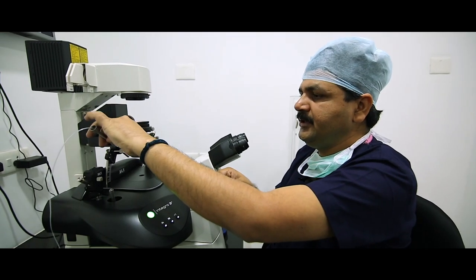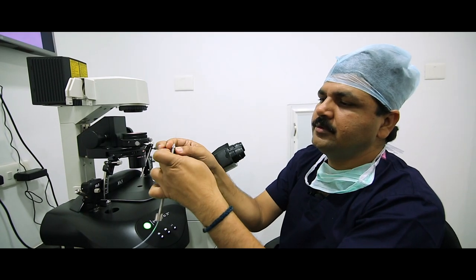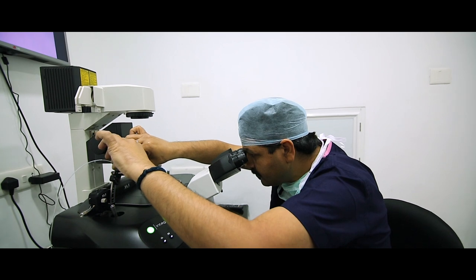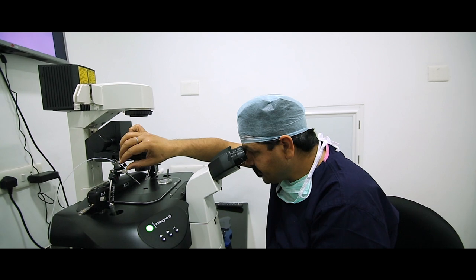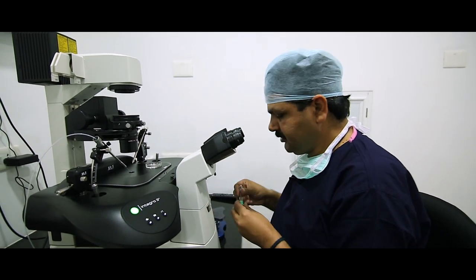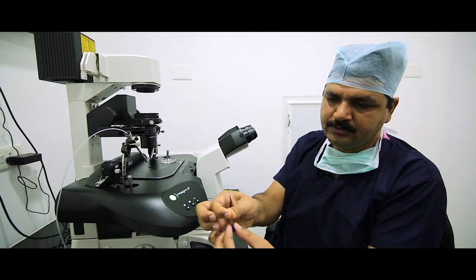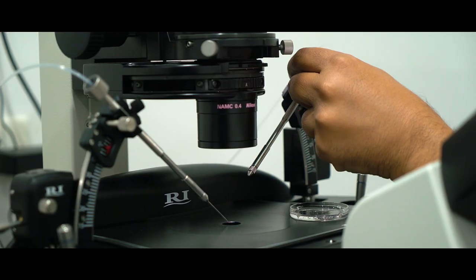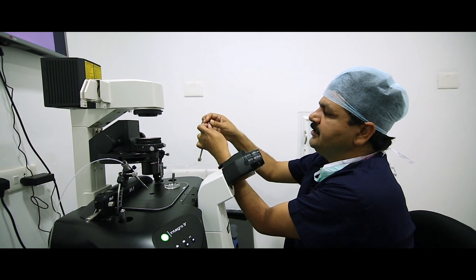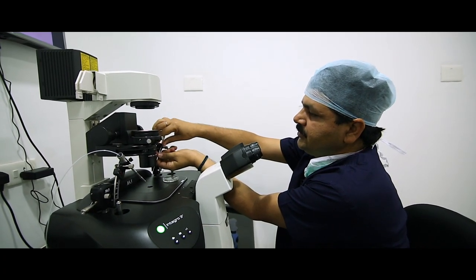Fitting the holding pipette and alignment: first align the holding pipette, then take the injection pipette. Remove the injection pipette, take out the holder, loosen the cap and fit it very easily. I am using a 35-degree angle injection pipette and holding pipette.